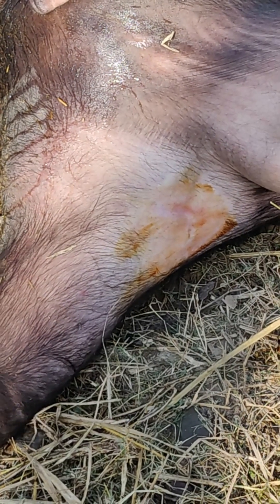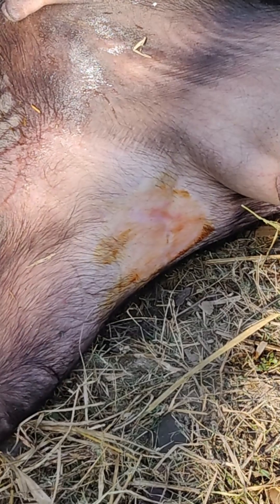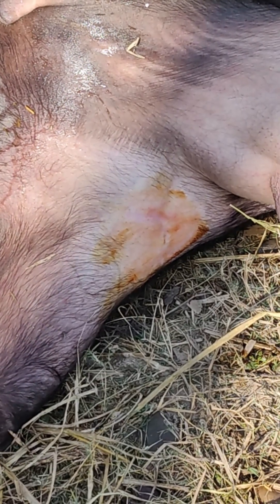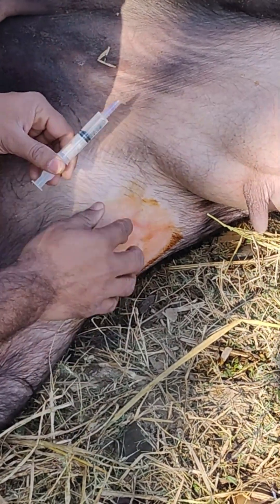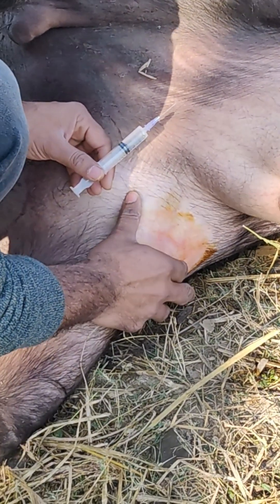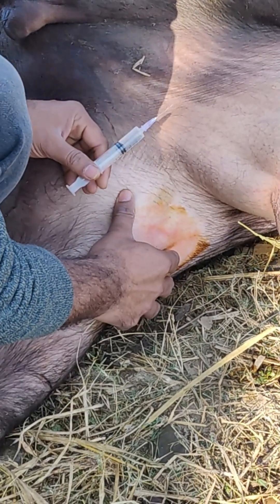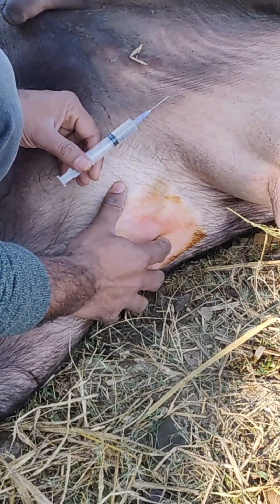Now after proper restraining of the animal and avoiding any sudden movement, local anesthesia is administered subcutaneously to the animal.